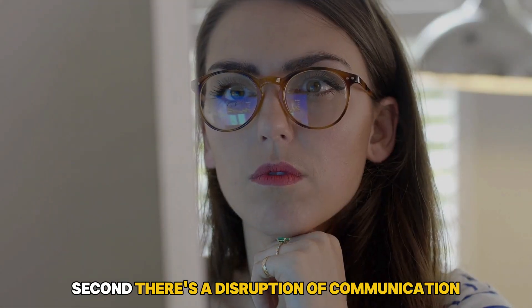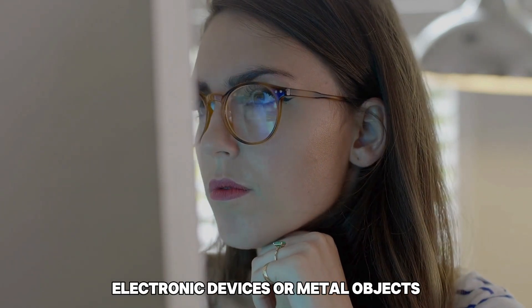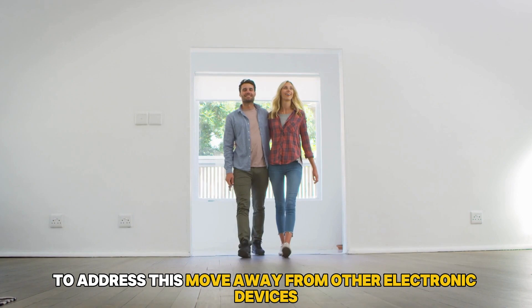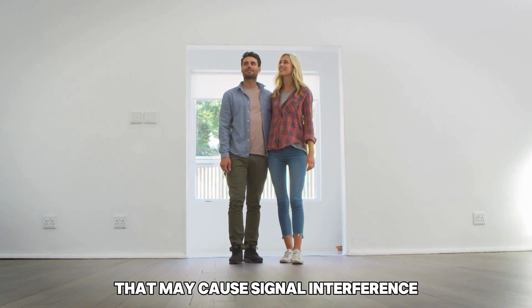Second, there's a disruption of communication caused by environmental interference. Electronic devices or metal objects can interfere with the PDM's ability to communicate with the pod. To address this, move away from other electronic devices that may cause signal interference.